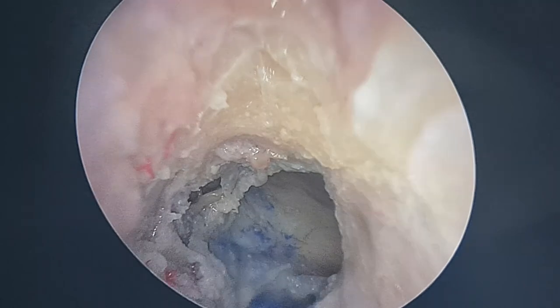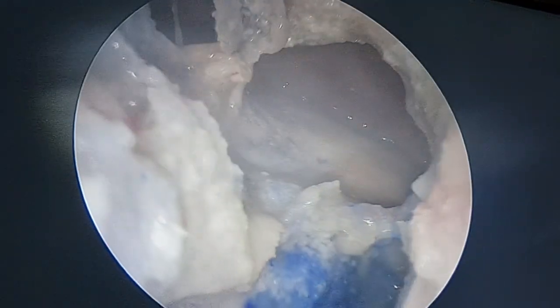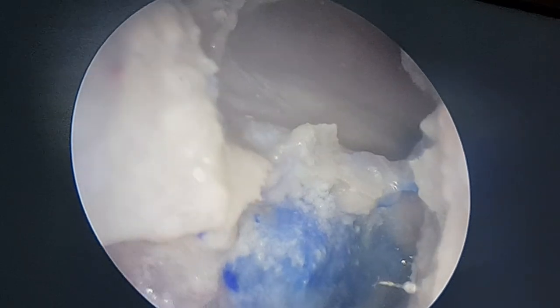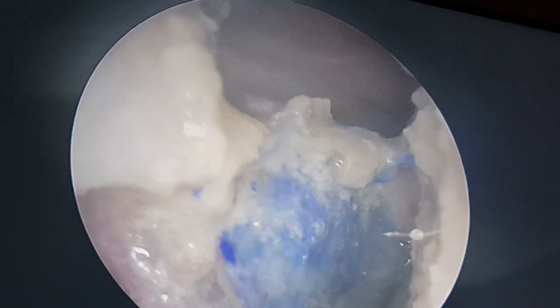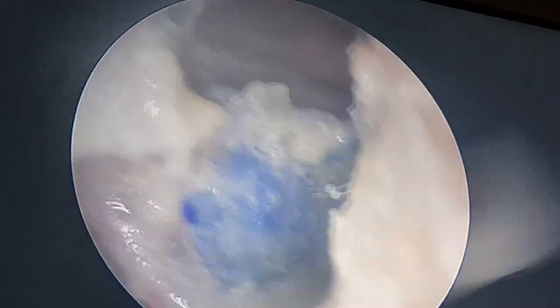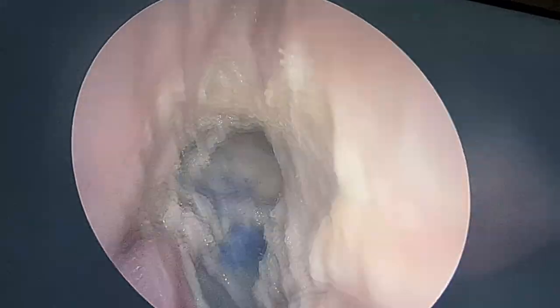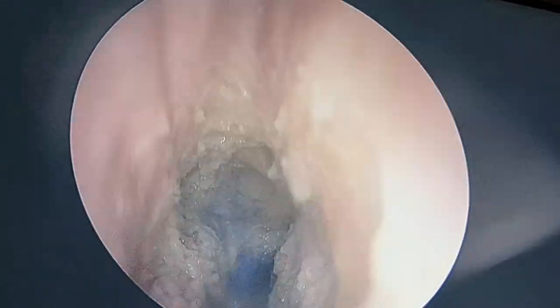You don't need to go to the opposite frontal recess and do a dissection. Many times you have a bilateral frontal sinus disease. If one side has disease and the other also, you can operate from one side and remove the intersinus septum. That's it. You have a far lateral recess, do the septotomy. So there are various permutations and combinations of the Draf you can take in your practice.